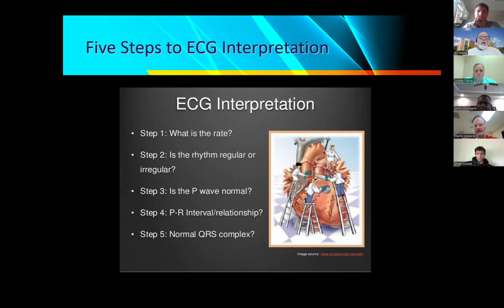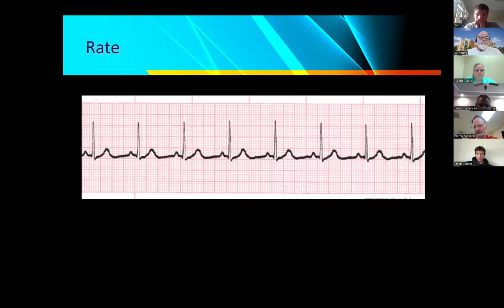All right. So, Sam, this one is going to be yours. All right. Let's make the assumption that everything that we're going to see on here is 6 seconds in length. So, Sam, what is the rate that you see here? And don't forget to unmute your mic there.